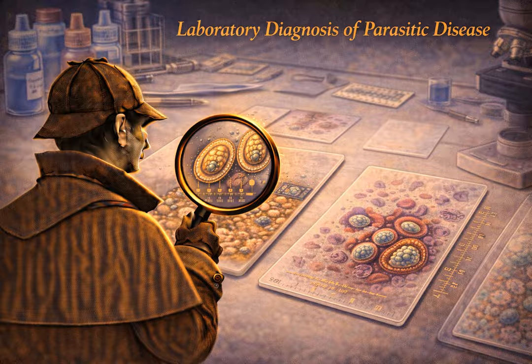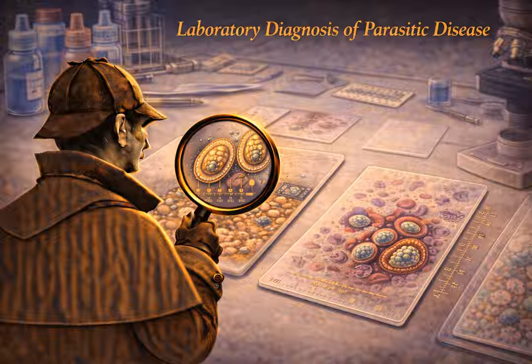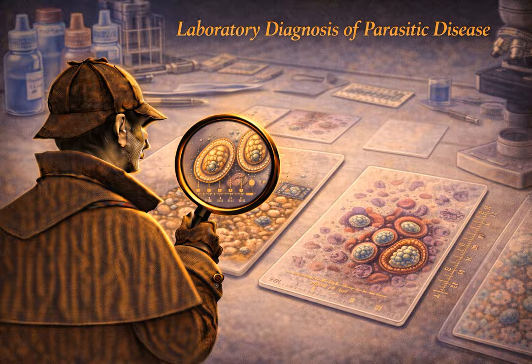And this is rapidly becoming the gold standard for things like Giardia and crypto, right? Absolutely. The enzyme immunoassays, the EIAs for Giardia and Cryptosporidium in stool are fantastic. They are significantly more sensitive than a human looking through a microscope. They don't require an expert parasitologist with 20 years of experience to read them, and they are incredibly fast. It gives the doctor a simple yes or no answer.